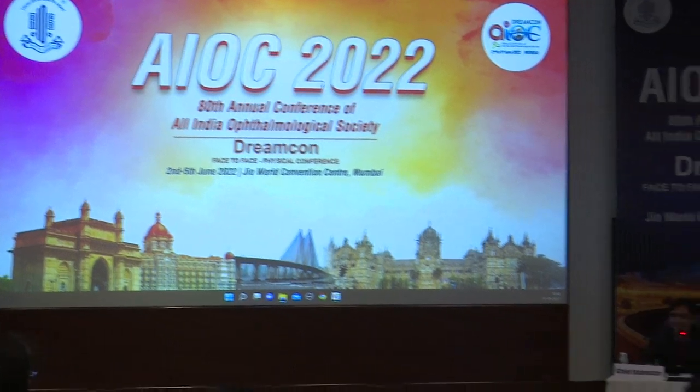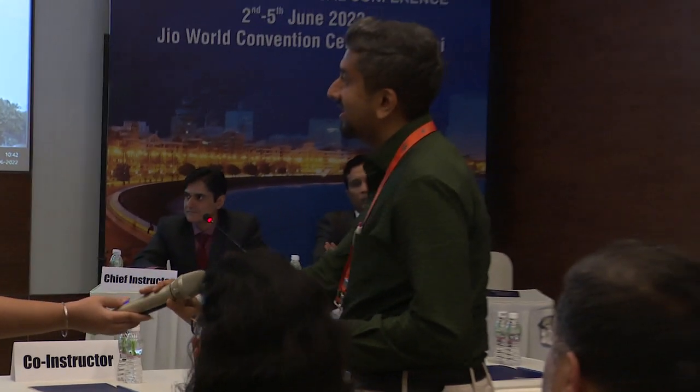Sir, any tips to remove the clot that forms? Sometimes the clot forms on the posterior pole by the time you finish a membrane dissection. Any tips to remove that safely without tearing the retina below, forming on the retinal surface? So the best way is that you remove the clot before it forms, but many times that does not happen.